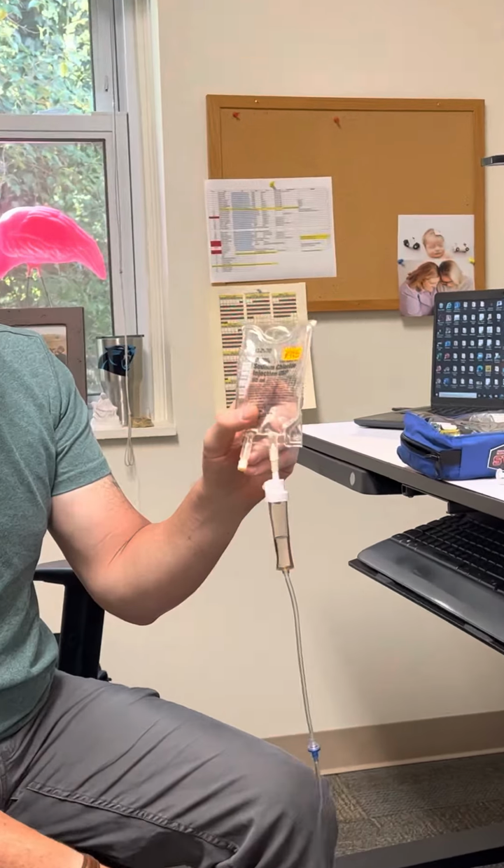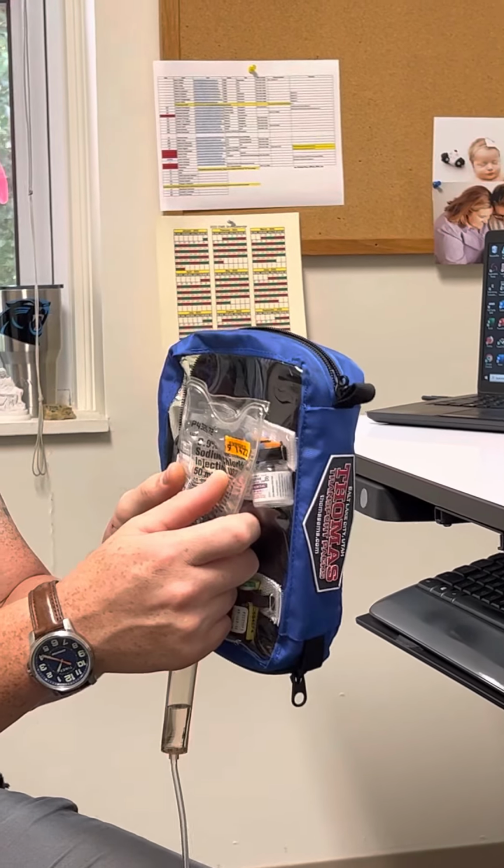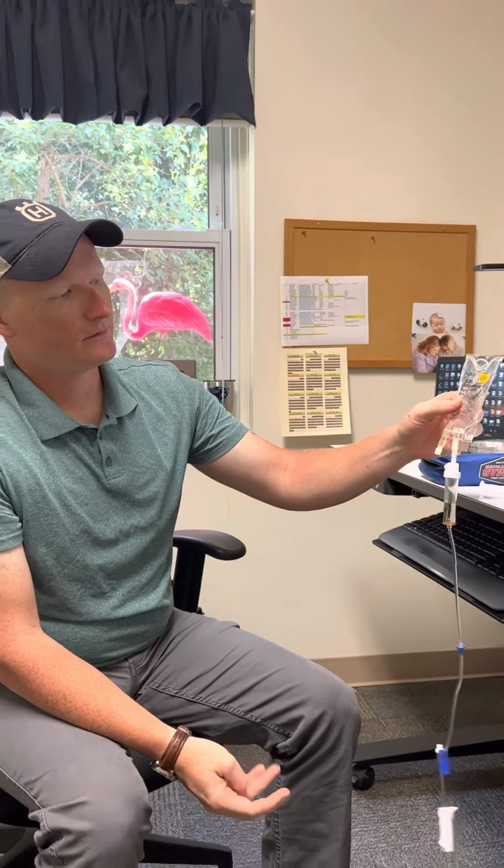So we're going to start stocking two 50cc bags of normal saline in the NARC box, in the NARC bag with the ketamine. So it should be right there. The reason why we're using 50cc bags of saline is because it reduces your math, so you don't have to figure out how much saline to pull up in a syringe versus how much ketamine to add to that. It's less load on you at the bedside. It doesn't matter what your dose of ketamine is, or how much they're going to get. You take your dose of ketamine, you put it in that bag, you hang it, and you let it go. That's it. This is just being treated essentially as a hanging pre-filled syringe.